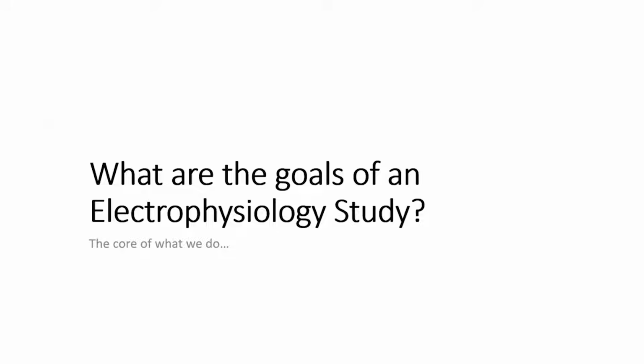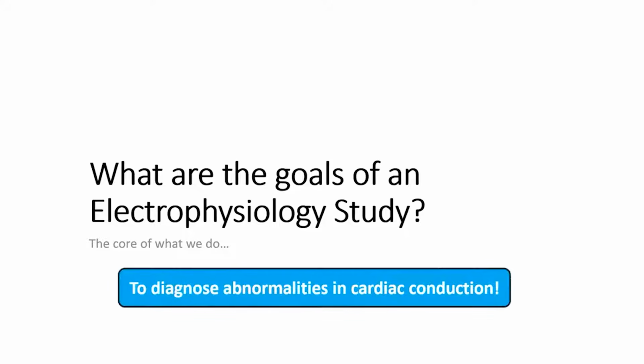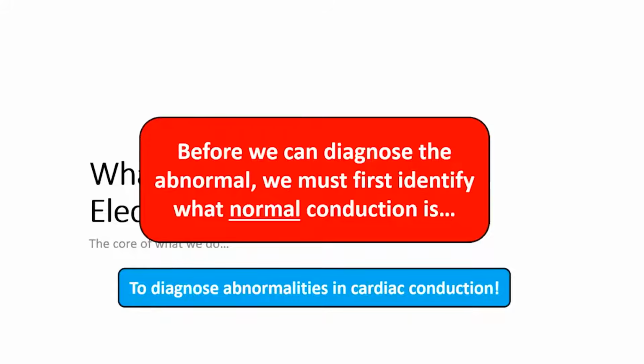So what are the goals of an EP study? Well, the goal of an EP study is to help diagnose abnormalities in cardiac conduction. But before we can diagnose the abnormal, we should first identify what normal conduction is.